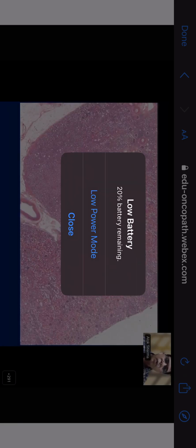So the artery at the bottom here is an arcuate artery, and then it keeps on giving branches throughout the kidney, the interlobular arteries, which again branch out into arterioles and keep on supplying the kidney. So the cortex is the area where most of the times the majority of glomeruli lie.